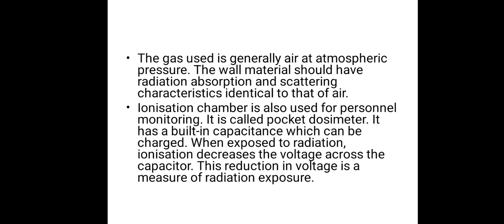The ionization chamber is also used for personal monitoring. It is called a pocket dosimeter. It has a built-in capacitor which can be charged. When exposed to radiation, ionization decreases the voltage across the capacitor. The reduction in voltage is a measure of radiation exposure.